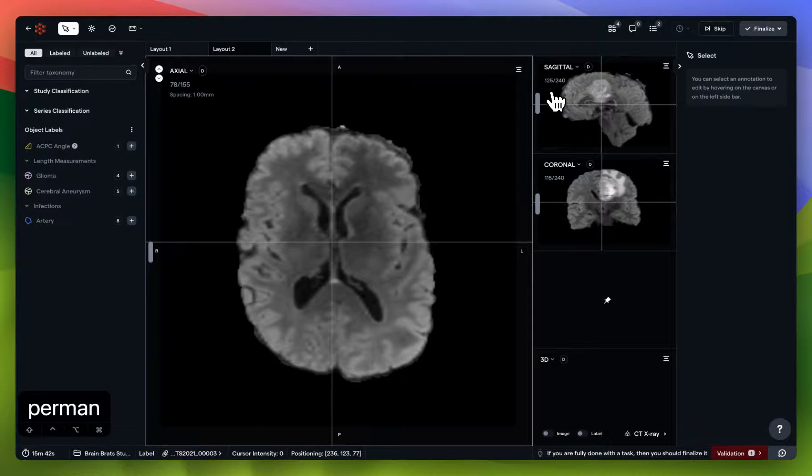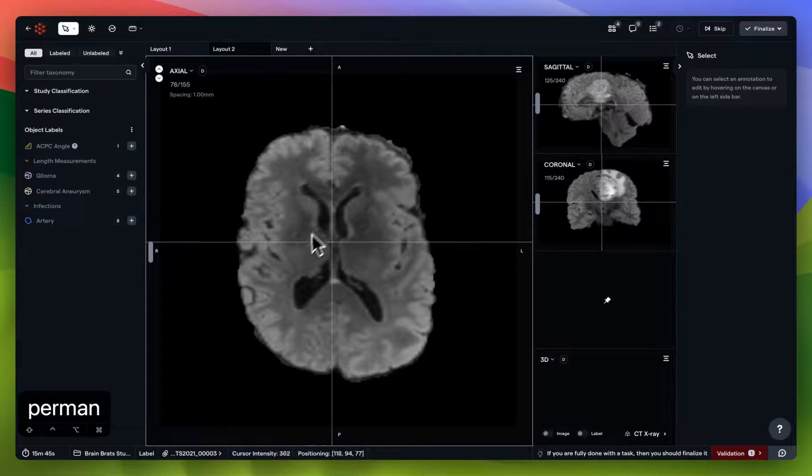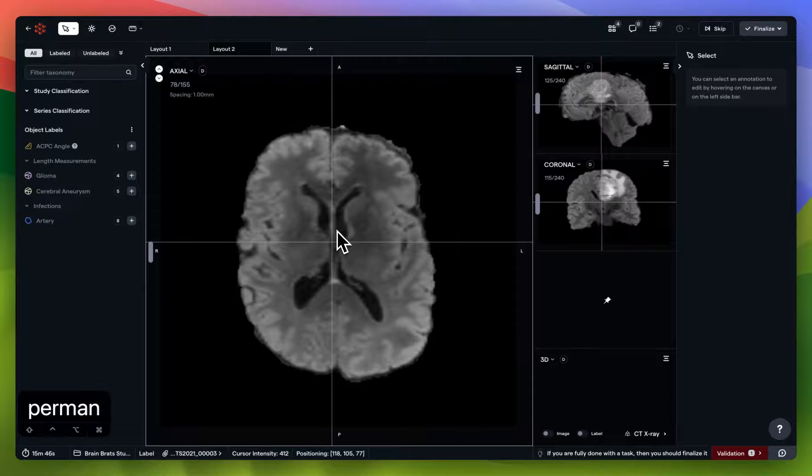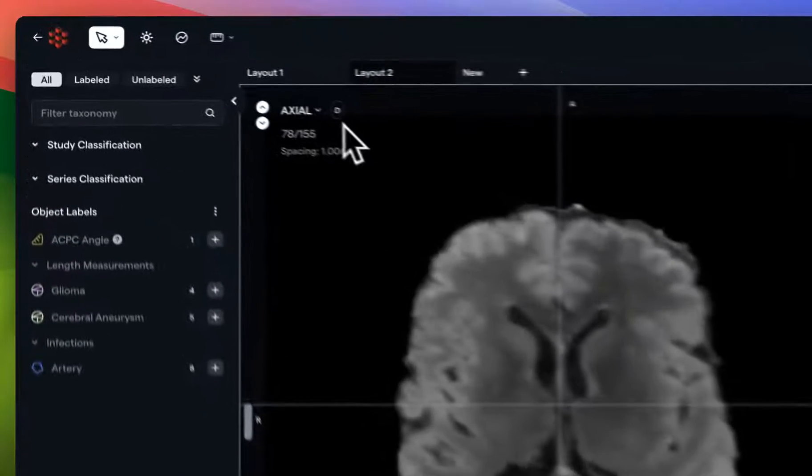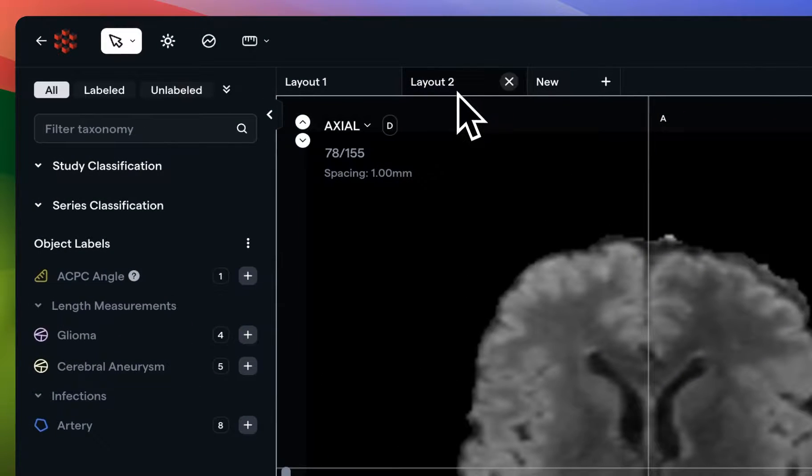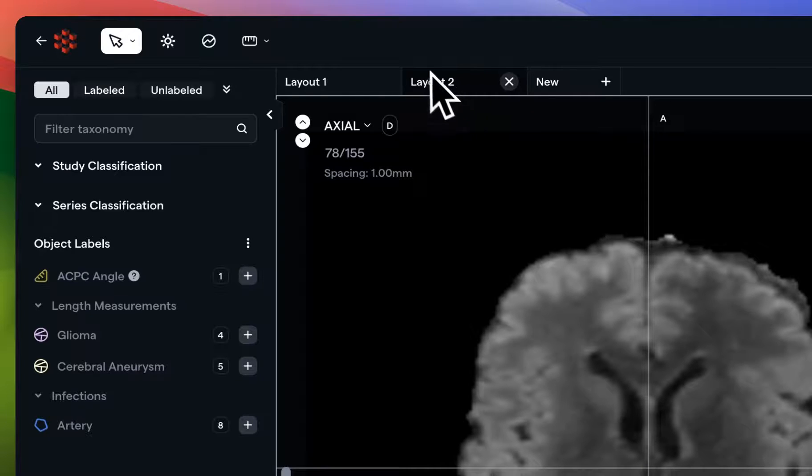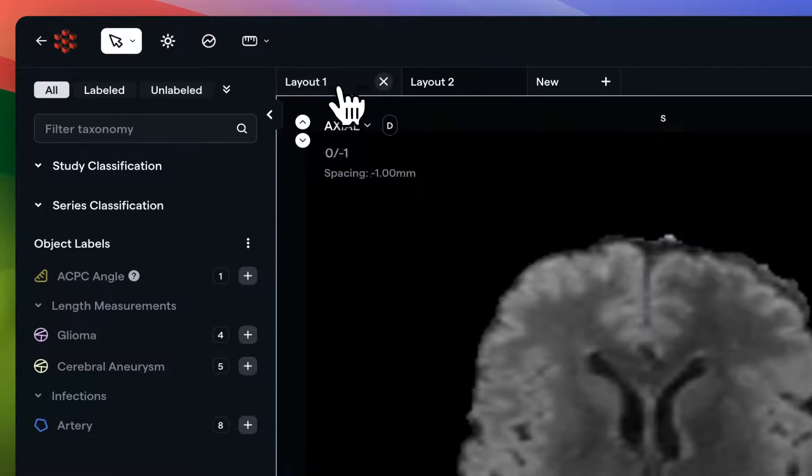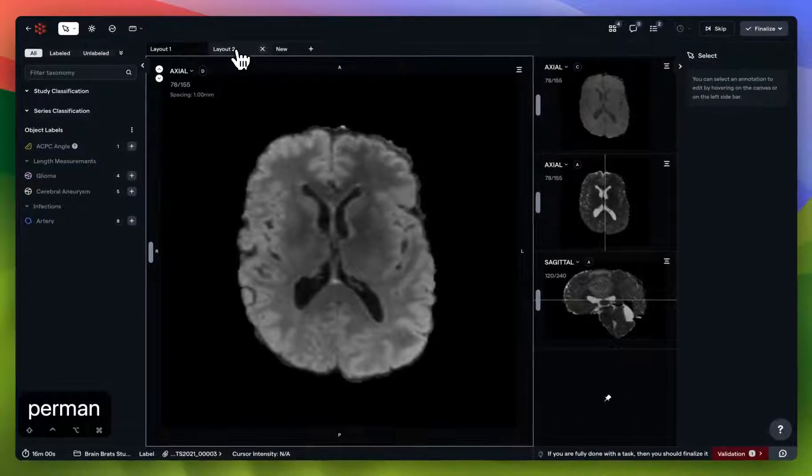One final note on MPR layout. Anytime you enable MPR layout for a specific series, in this case series D, you'll create a new layout tab for yourself that you can easily reference in the future. I'm going to return to our original layout tab here, so that we can continue the tutorial.